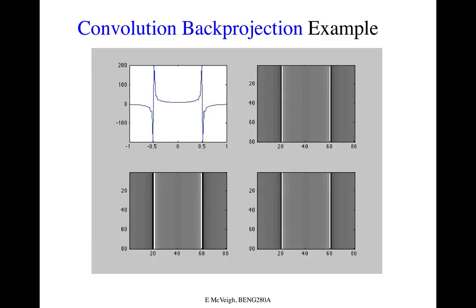When we do projections and try to look at how many views is enough to get a discrete enough picture, how does that decision get made? Okay, so the question is, and it's an excellent question, sort of the fundamental question in CT: if you want an image of a certain quality, how many projections are required? We'll actually derive an equation for that, but it's on the order of this: if you have a 512 by 512 image like this, you need about 512 projections. But there's a pi factor that comes in there because they're circular projections and so on.